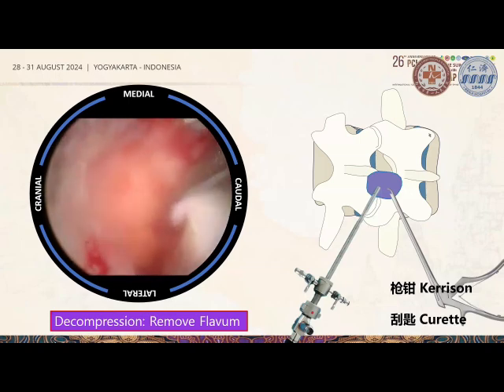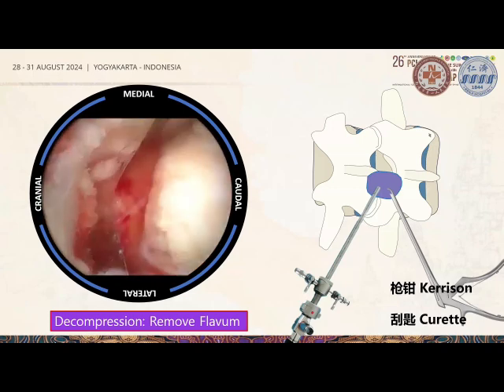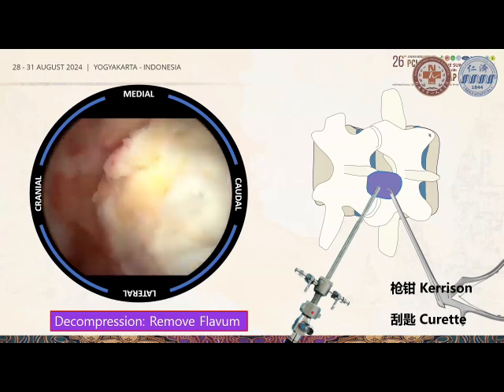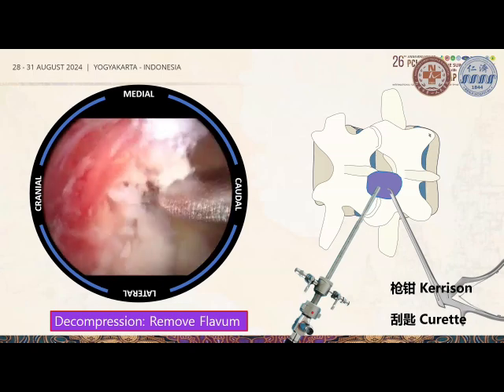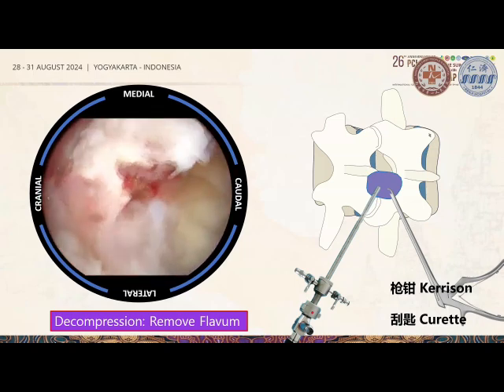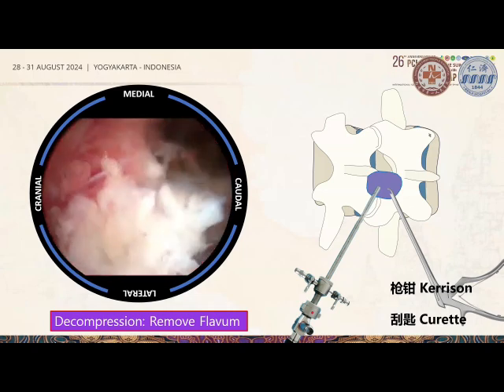At this point, we can decide whether to perform over-the-top decompression on the contralateral side, typically following the ligamentum flavum to the opposite side. In this case, the patient has no significant central or lateral recess compression, as it is a lytic listhesis. The priority is reduction of the listhesis and decompression of the exiting nerve roots. In grade 2 and above spondylolisthesis, it is advisable to remove both facet joints so that upon reduction there is no impingement of the contralateral exiting nerve root.